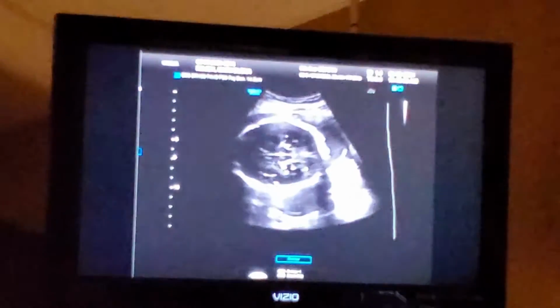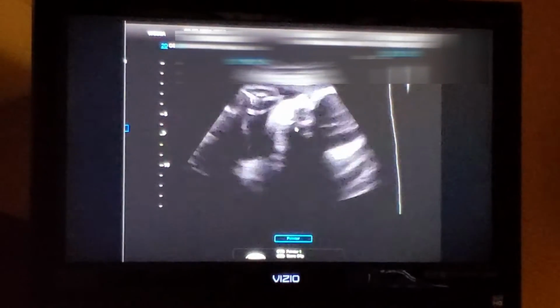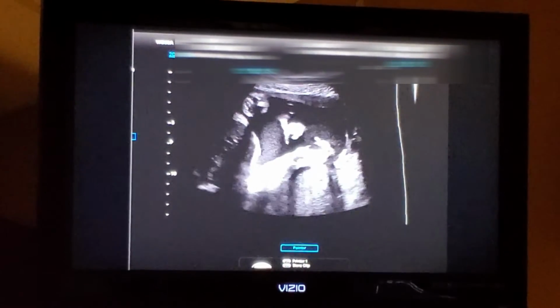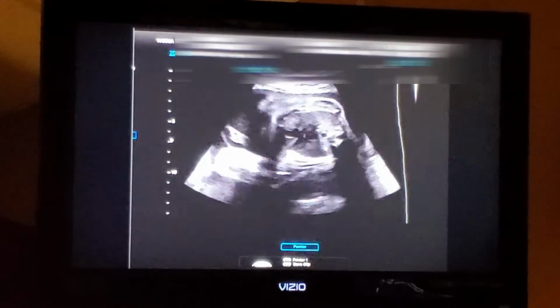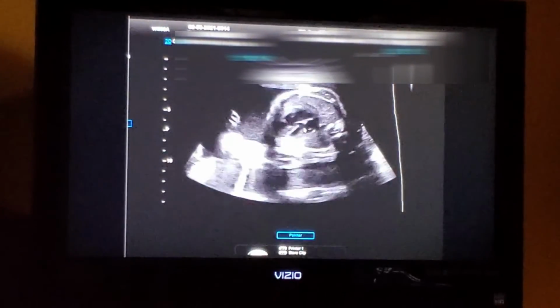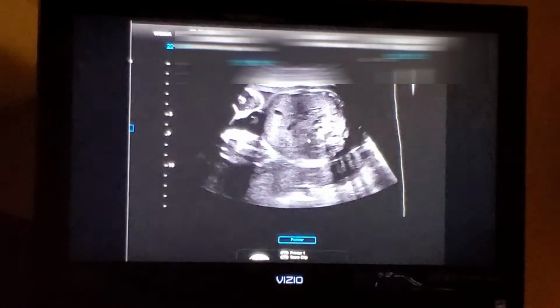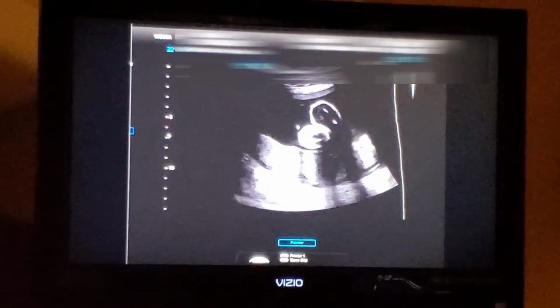So I'm going to go back through the anatomy here, okay? Here's her lateral ventricle in the brain. That rules out hydrocephalus. Cerebellum, the shape of that looks good. That generally rules out spina bifida. Here's the baby. There's her face, her hand, her top lip, no cleft lip. She's got some hair there. Here's the 4-chamber heart. Outflow tracts look good. Stomach, kidney, bladder. Yeah, you can see how fast the heart's beating.